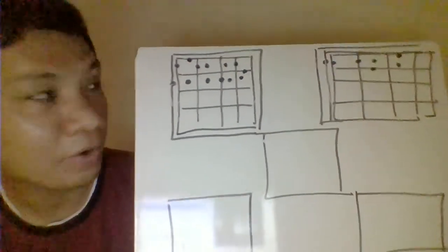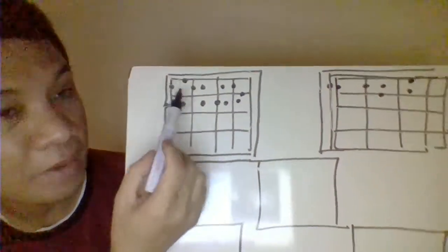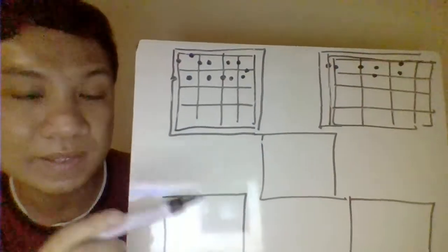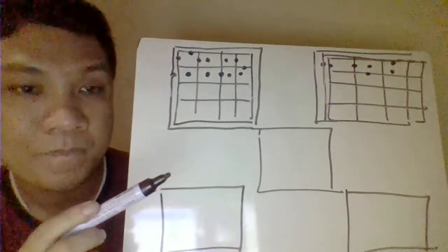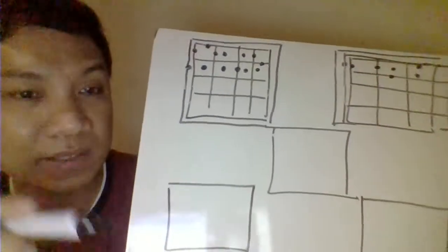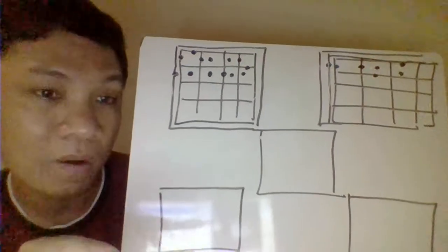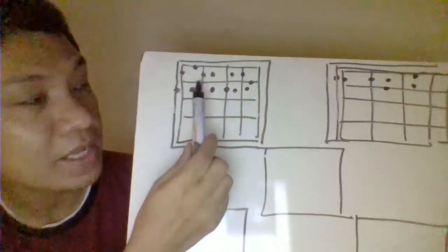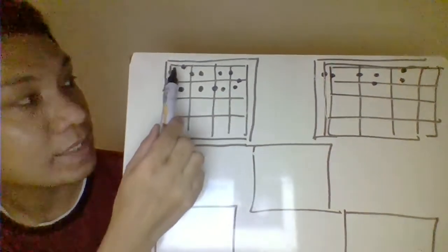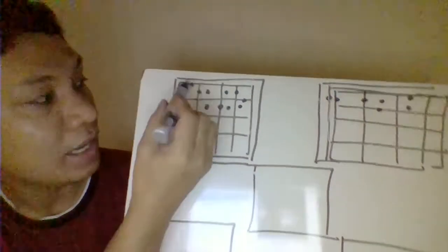So, paano ang, like for example here, dito ka mag-start. So, for example, may cell tayo, may RBC tayo dito na ganyan. Okay, so ang i-count lang natin na cells dito ay yung mga bilog na mga RBC natin. Yung may mga nucleus, okay, those are your WBC, do not count that one. So, yung mga bilog lang na wala siyang laman sa loob, that your RBC. So, again, you start here. So, for example, ano ang ulit boundary natin? Left line, since dito siya, sa upper line, okay, so dito mo siya i-count. So, for example, this line, square is, ang bilang natin ay 2.